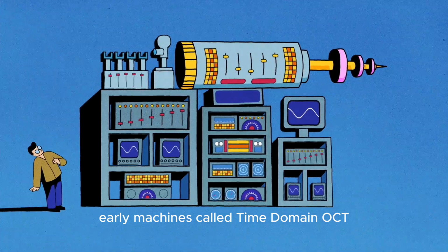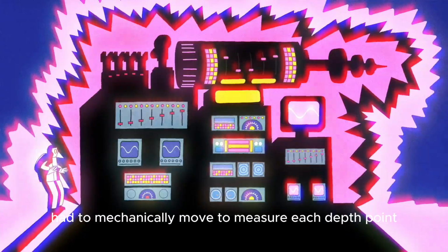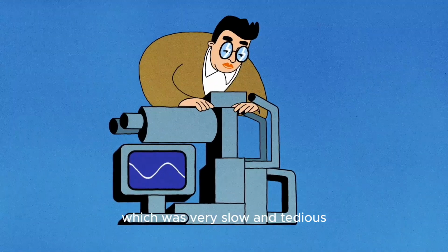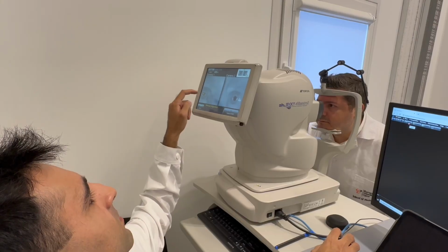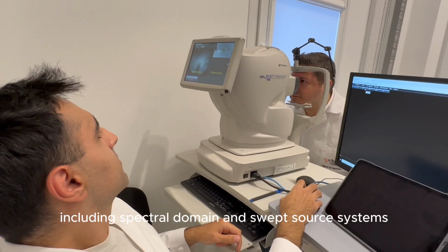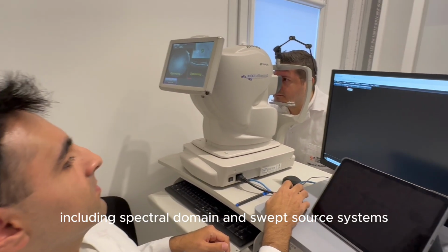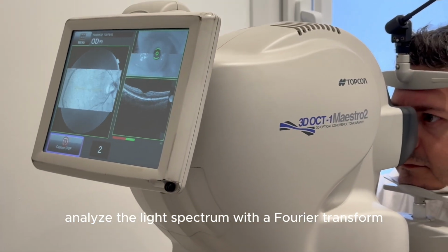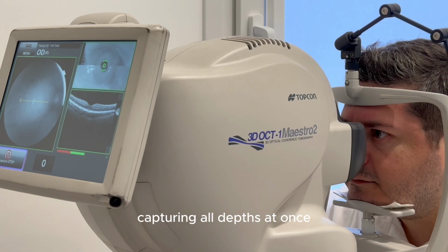Early machines, called time domain OCT, had to mechanically move to measure each depth point, which was very slow and tedious. Modern Fourier domain OCTs, including spectral domain and swept source systems, analyze the light spectrum with a Fourier transform, capturing all depths at once.